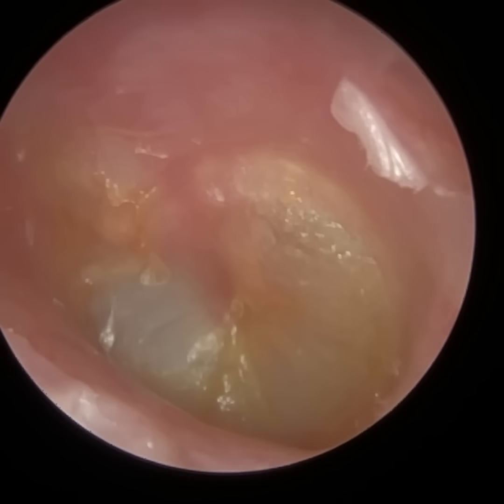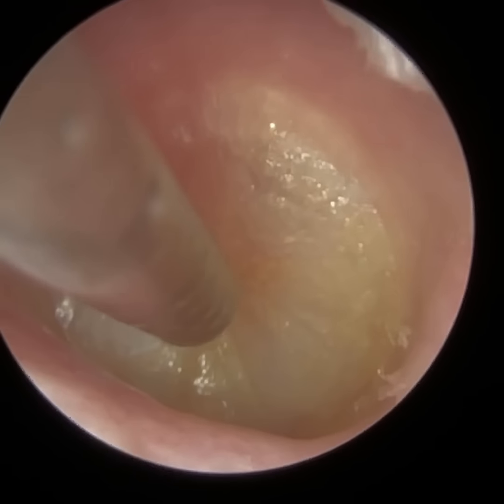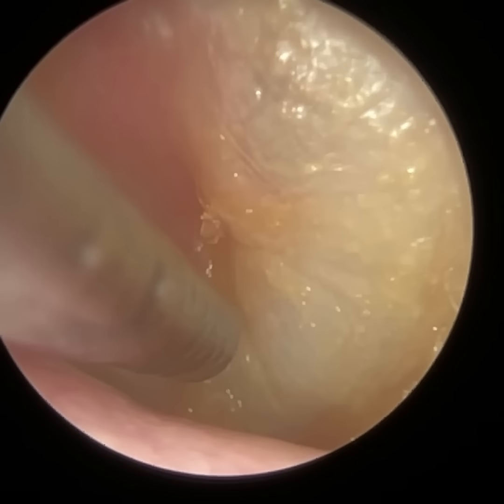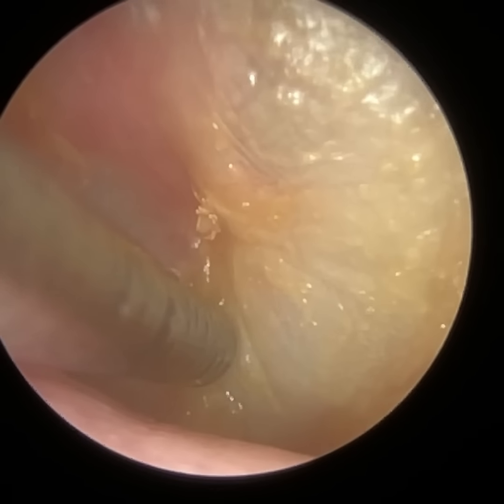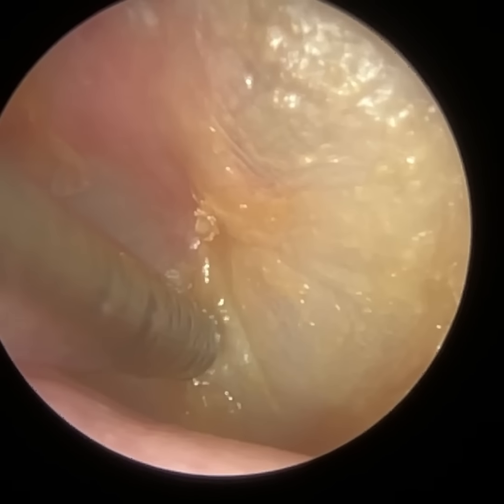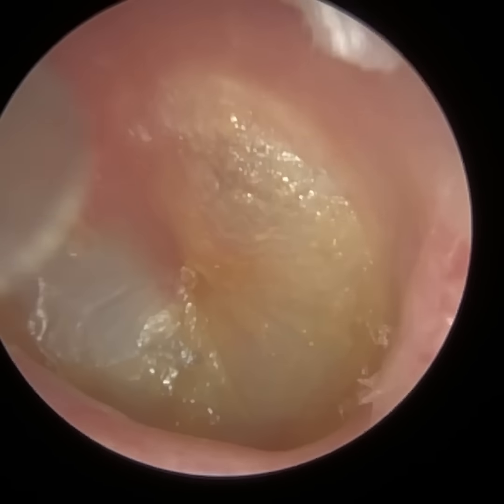So that you can see the whole eardrum. Yeah, you can see between about 1 o'clock and 7 o'clock, there's the thinnest sheet of skin, but it wasn't going to come away. And as I said, the patient did get a bit dizzy, so we just left it. And the eardrum just flexed there slightly, so we're going to be careful.